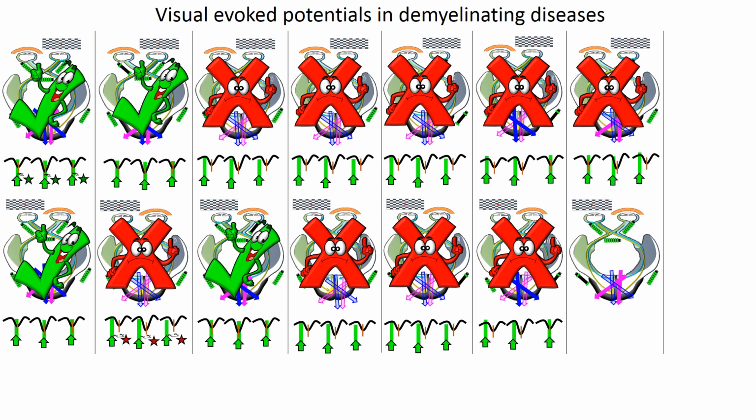The new figure I have just introduced represents a similar lesion but depicting the effect of left eye stimulation. This will produce a delay in right parasagittal and sagittal P100, but the left parasagittal P100 would be normal. So the left eye will be abnormal.